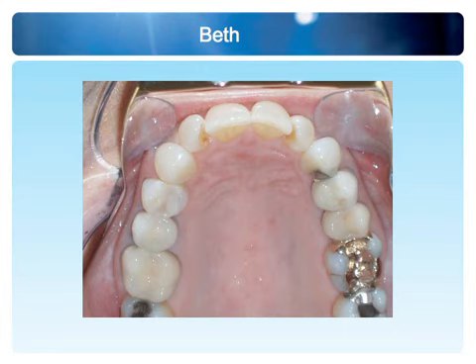And part of the reason why she is shy is because the teeth didn't come in perfectly straight. So, if I take someone who is 30 or 31, I know I can look for 4 millimeters of expansion here. And if I did 2 on each side, I would immediately look at the foundation past my mirror and say, wow, there is a pretty good amount of alveolar housing over here. If I can see the structure outside of the molars and premolars, I'm really in good shape to give myself a couple of millimeters of expansion on each side.